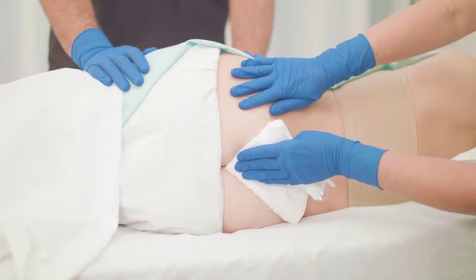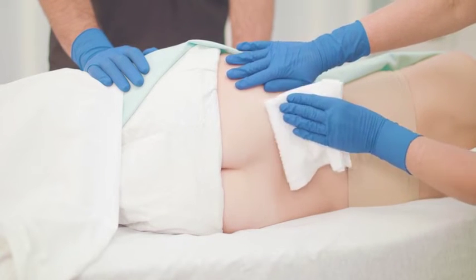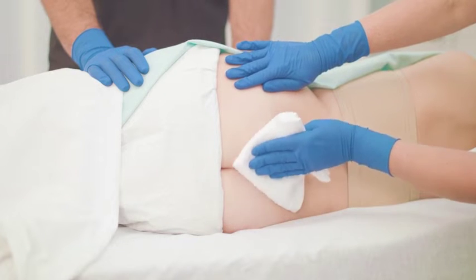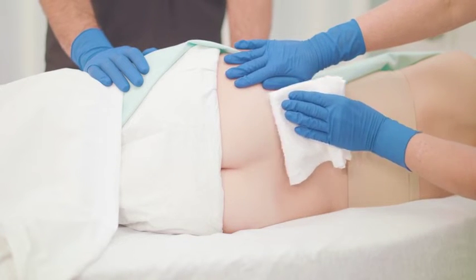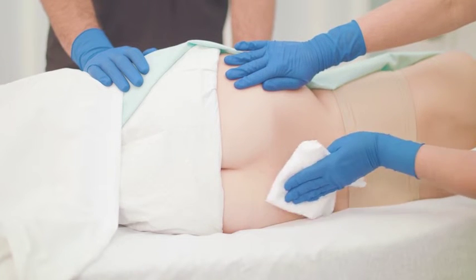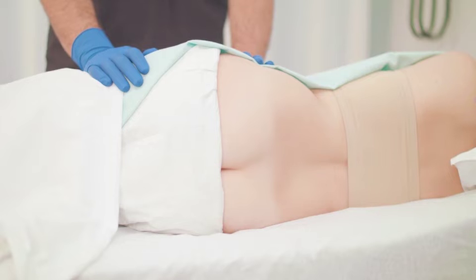Prepare the area by cleansing the intact skin and drying the surrounding skin thoroughly. Unless skin care products are SafeTac compatible, such as Prevacens, ensure that skin is free of dimethicone, skin sealants and emollients. Use of a skin barrier under the dressing is not required.